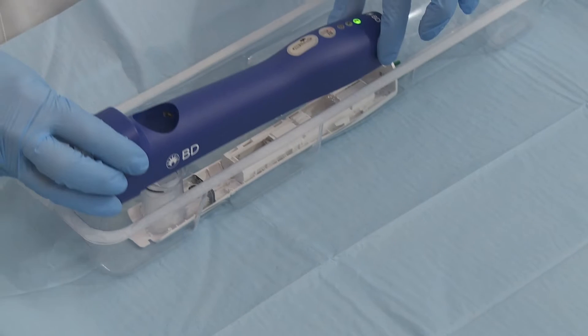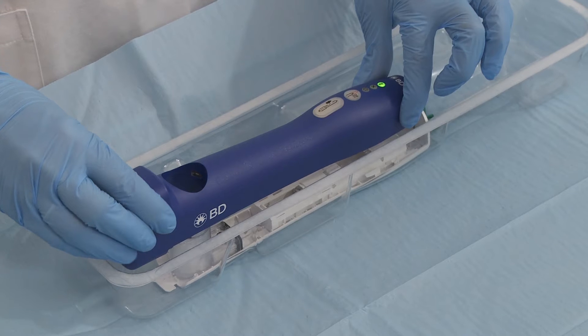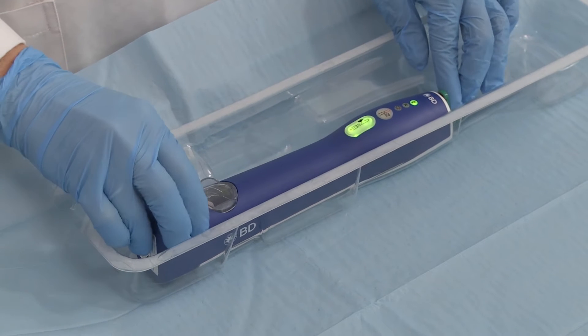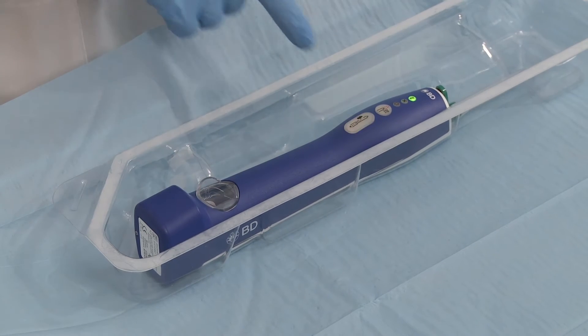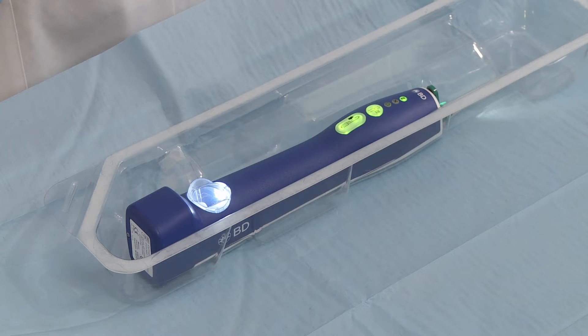Option 1: While the probe is in the tray packaging, align the driver with the corresponding probe tabs and sample container opening, and slide the driver forward to lock into place. The sample button flashes green. Touch it to synchronise the probe with the driver. The device is ready to use.